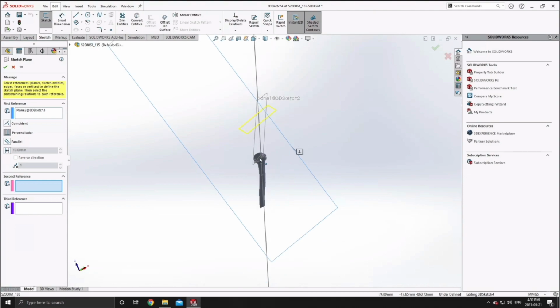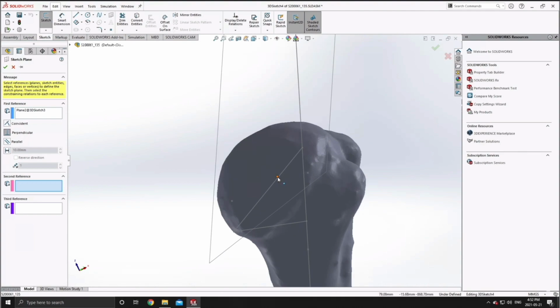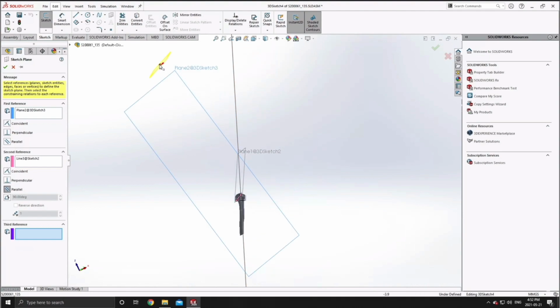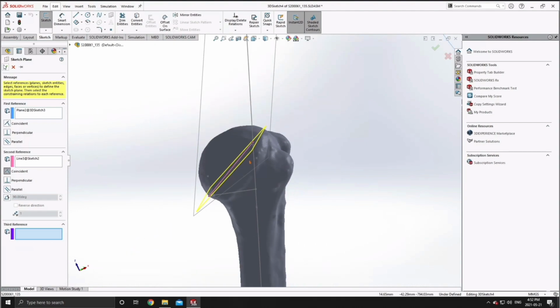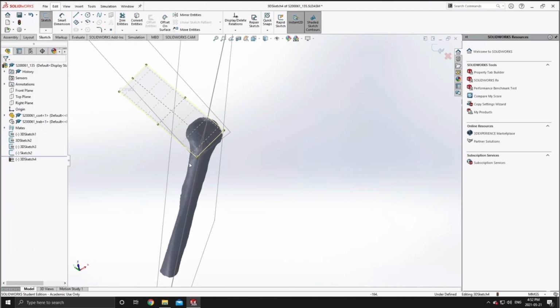So now that we've isolated and measured all of our relevant retroversion, lateralization and neck shaft angle, of course there's 3 important relationships that we need to take into consideration. The first positioning relationship is relative to the neck shaft angle, wherein the resection plane must be parallel to the indicated inclination that we defined before. For the purposes of this example, our inclination is at 135 degrees.